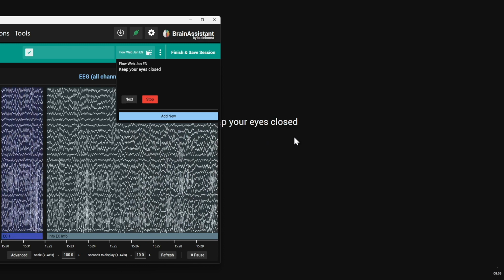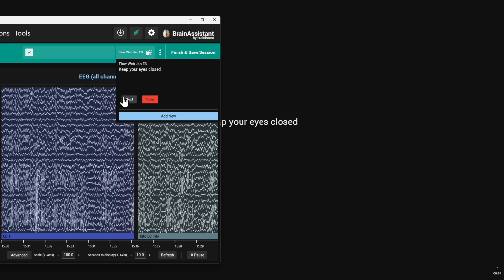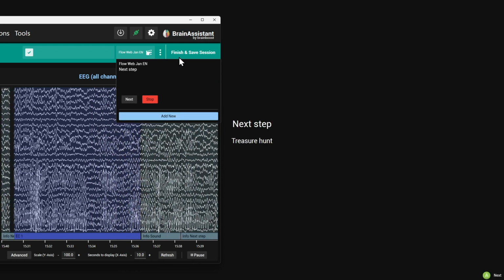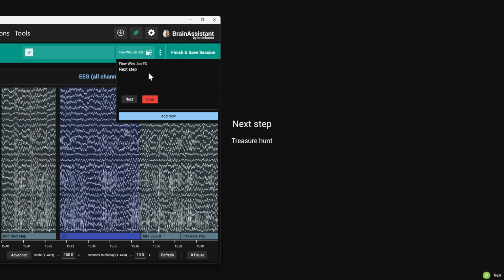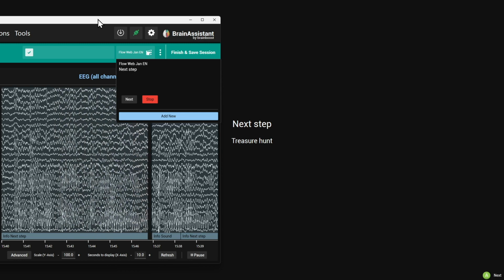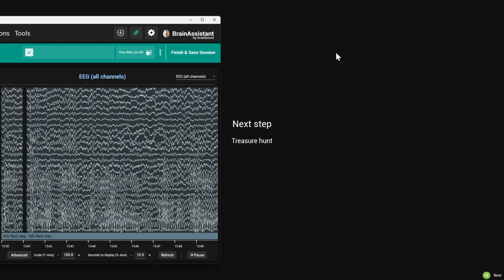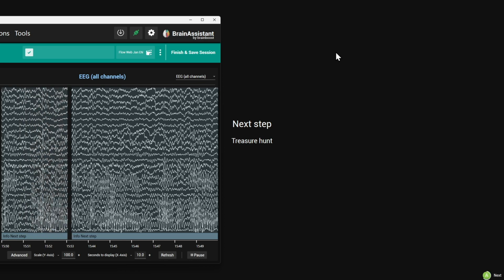Next, please keep your eyes closed. This was the 10-minute part. We're not going to wait 10 minutes, but you see now an eyes closed segment starting. Next, ding. At least I heard the sound in my ear. This was the sound, and I set it so that after the sound, continue with the next step. So I don't have to press A or do it manually here. And of course, I'm now pressing A on my controller.